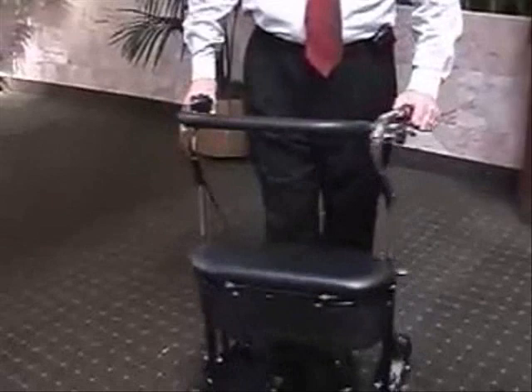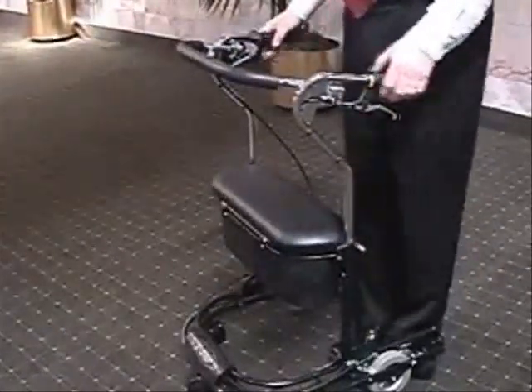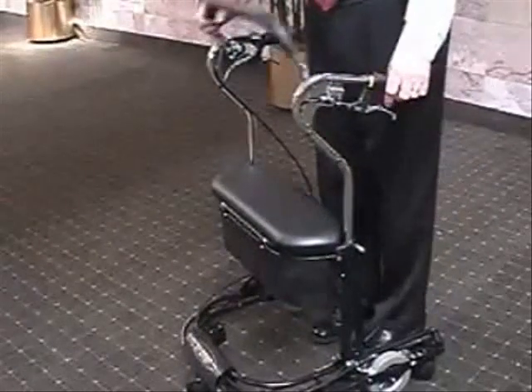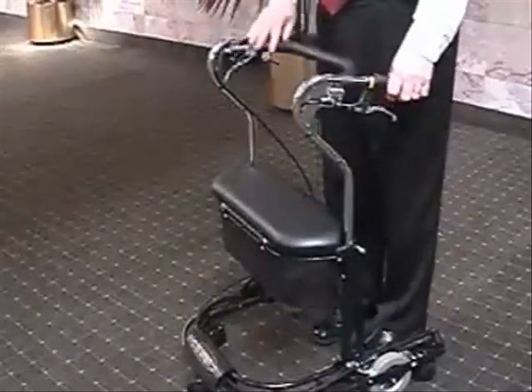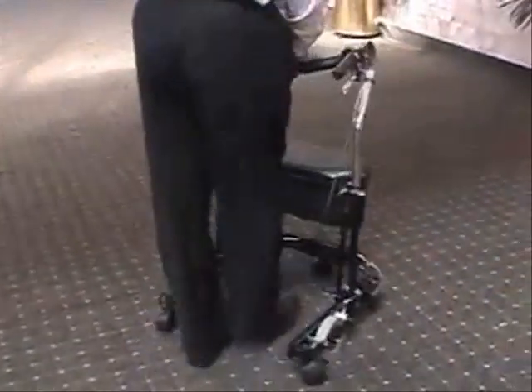What's also nice about the unit is that if a person can't use their hands well — if someone has limited use of their hands — they can actually flip this bar back and just press down with their hands and use it more like a shopping cart. So that's another way to use the brake resistance.